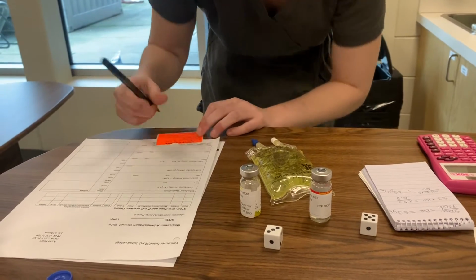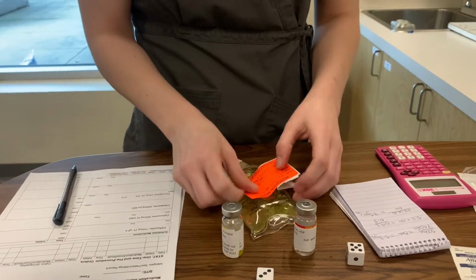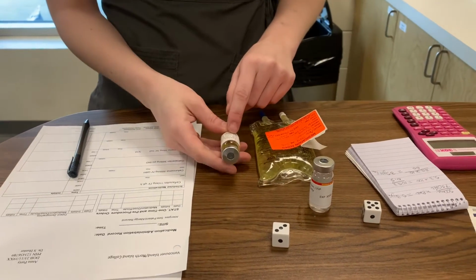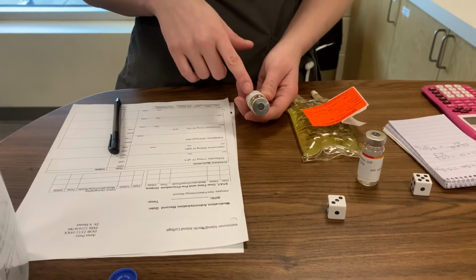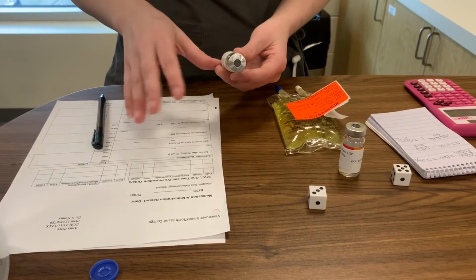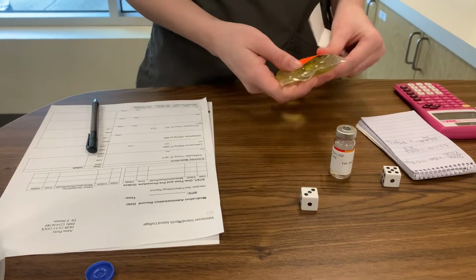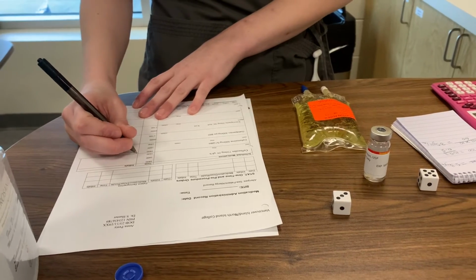Perfect. Wonderful. So now that that's all good, I can go ahead and add this. And I'm just going to go ahead and do my final check before I dot my MAR and go to the patient's room. So I have my cefuroxime, 500 milligrams, wonderful. IV, 0800 for Anna Perry, perfect. Right time, wonderful. So I'm gonna go ahead and just pop that right on there. And then I'm going to dot my MAR.